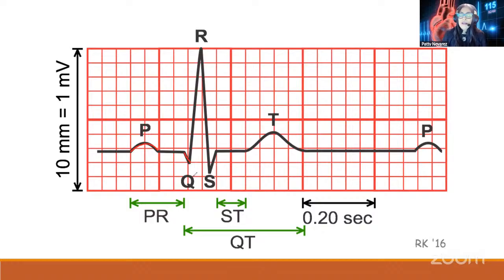That's why we have so much information on this deflection, which is between positive and negative, just the way it is in the heart, the way the electrical conduction goes. After the conduction goes through the bundle of His, it separates into right and left bundle branches, and then to the Purkinje fibers to finally all together help contract the ventricles. So that's what the QRS represents. Together they form the QRS complex, which is the depolarization of the ventricles.